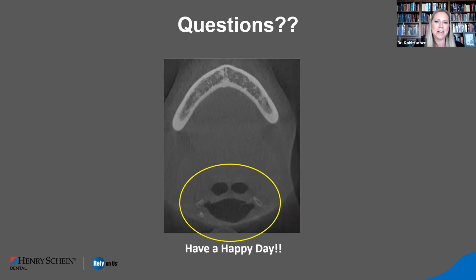So yeah, now how much dose is that? For comparing one CBCT with, say, a panoramic image, we can say an 8x8 centimeter field of view, which is maxilla and mandible, will be equal to about 5 to 6 panoramic images. Do you need one before and after? Well, definitely before. I would definitely take one before. After, you're going to have your implant in place.